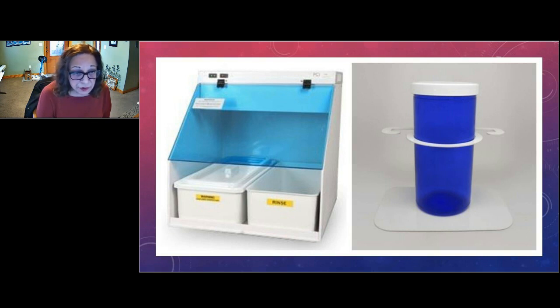One quick note: if you are going to use such a thing as a soak or disinfection station, they have filters and they do require some maintenance. Pretty much most of the soak stations I've seen, the only true maintenance is changing the filter, like every 6 months or periodically, whatever the manufacturer of that soak station requires.